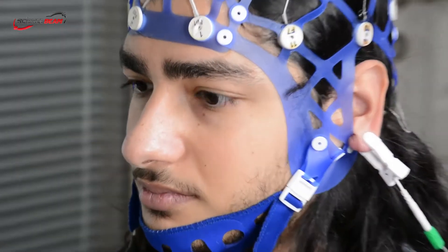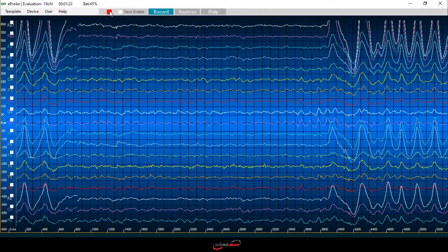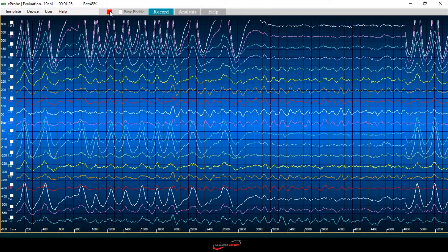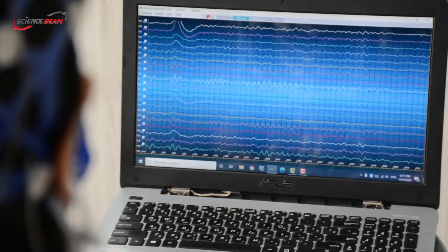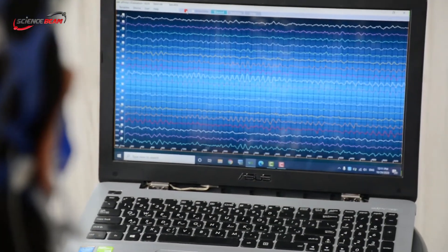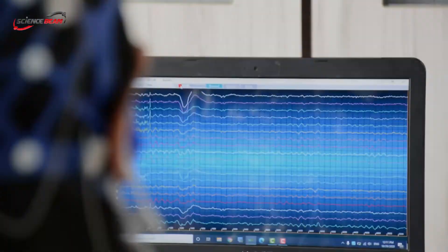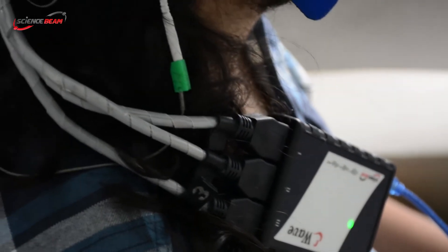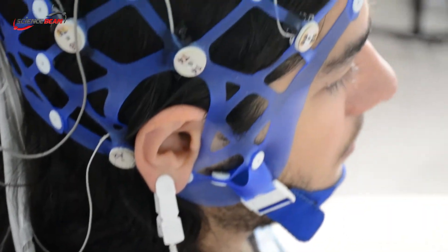Ask your client to blink slowly. As you can see, the blink artifact can be observed in the channels near the forehead.